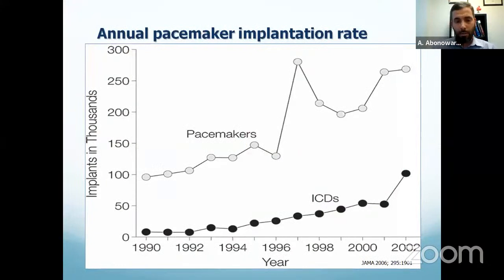Pacemakers are increasing in numbers, and we can see that clearly in our center. The numbers are growing. So from that, you expect to see more complications coming to the emergency department. So we have to be aware of that. And the numbers are going up clearly, both for ICDs and CRTs and pacemakers, but pacemakers definitely way more.